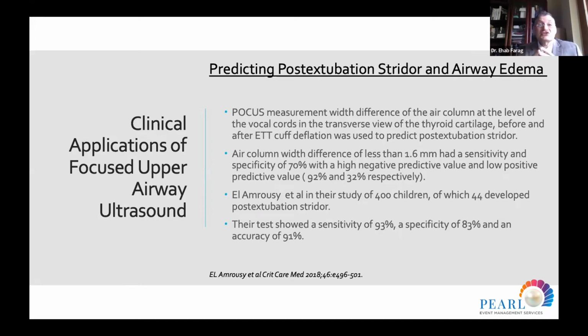That is also consistent with the air leak test for extubation, when you are measuring the difference in airflow. When the airflow is more than 100, that's an indication that the patient has no upper airway edema. However, less than 100 usually predicts airway edema.